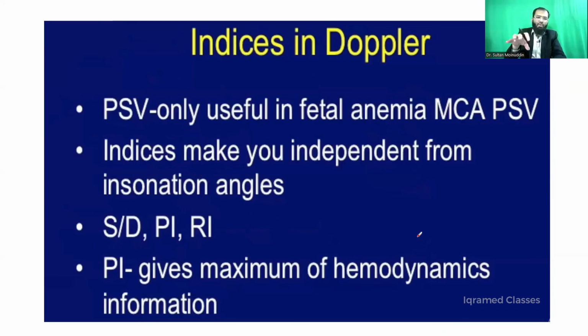Now let's come to the technical part. Okay, for the technical part. So PSV.